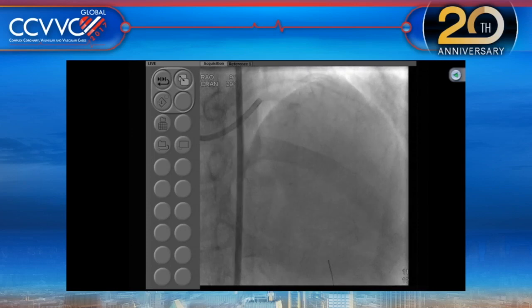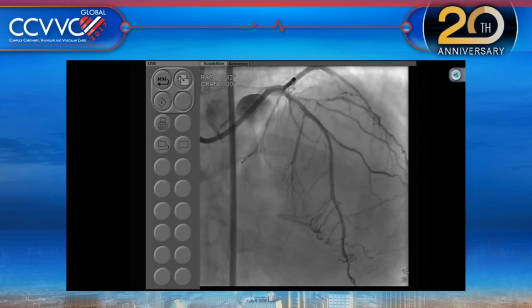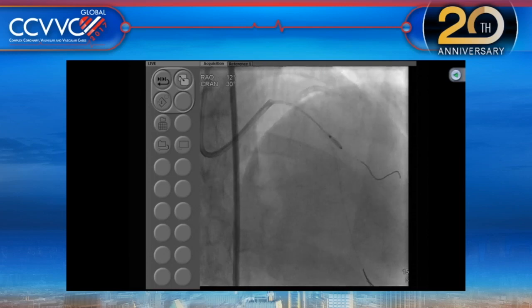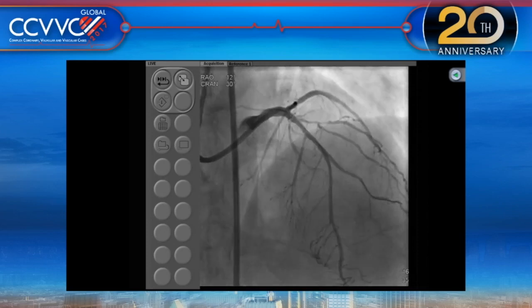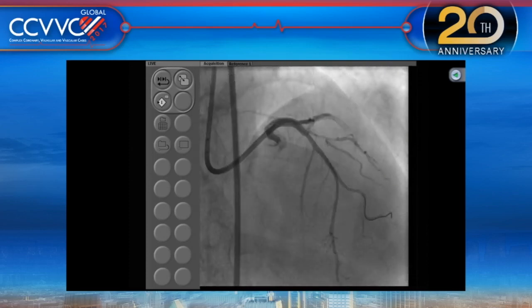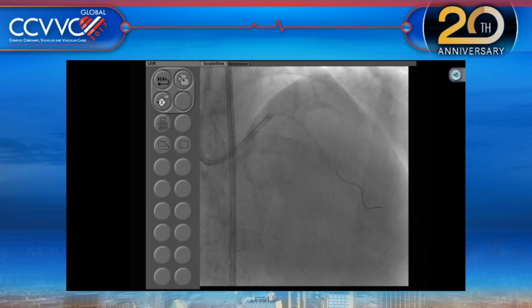And this is done by Joe, and we dilated with a balloon. We felt that it's a small vessel, a side branch, 2.25, so just do a Flextome cutting balloon, and we did 2.25 with multiple dilatations. And this is where we are. So the ostium is looking perfect, LAD here. We decided to begin in this case with a 1 stent approach in the LAD, and we are ready now with the 3.0 by 28 Synergy. While you're having a discussion, we are just going on because we want to finish this case quickly and then go to the next one, which will be ready in the next few minutes.